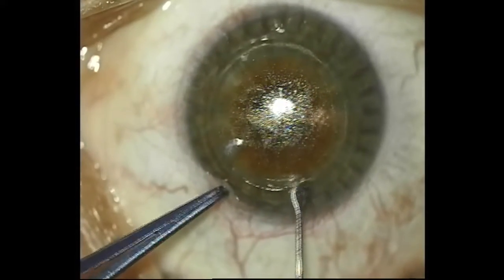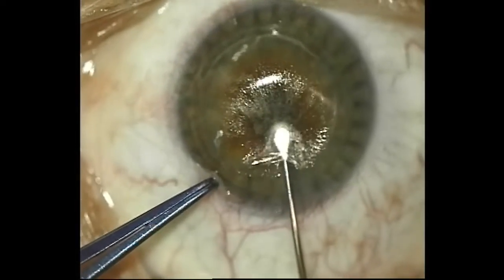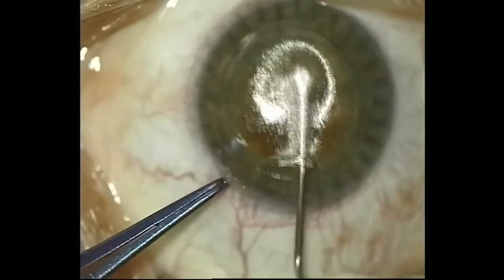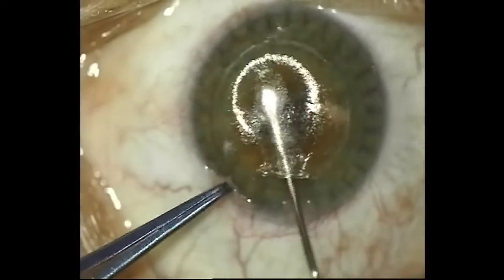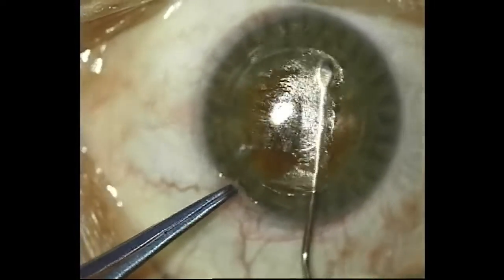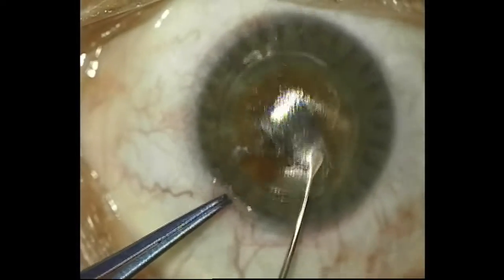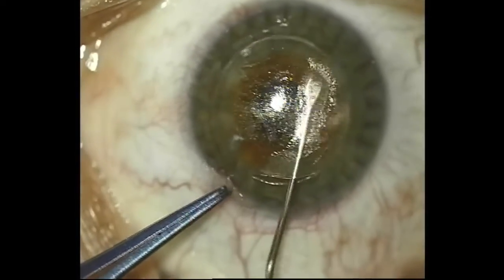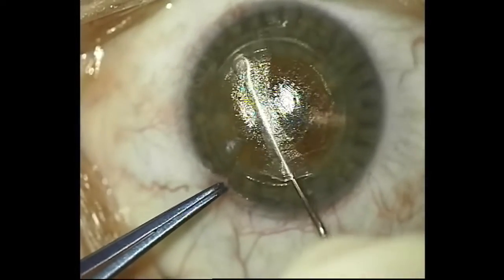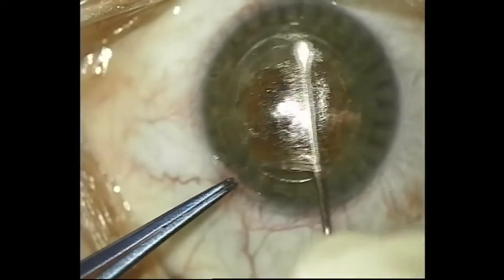Now I'm coming out and aiming posteriorly to the posterior plane. You can see there are gas bubbles above the instrument — the dissector appears more dull and blurry, which means you're in the posterior plane. I use the same windshield wiper motion. Don't be in a hurry — there's sometimes a little more resistance in the posterior plane. I'm going to leave two anchors on each side, because that prevents the lenticule from bunching up and making it difficult to remove as one piece.